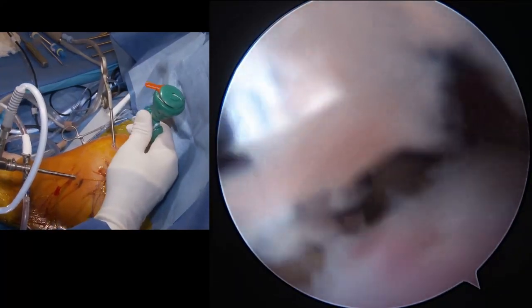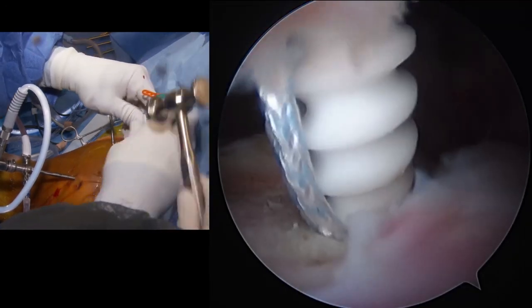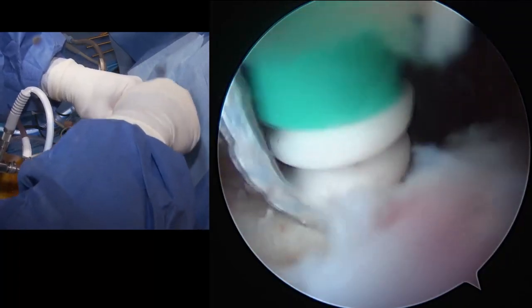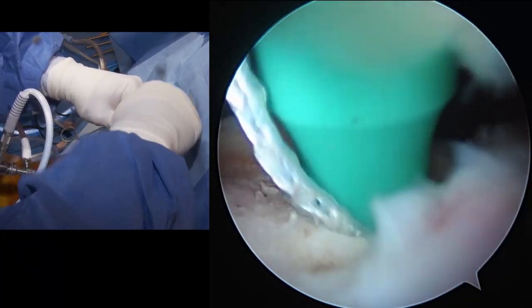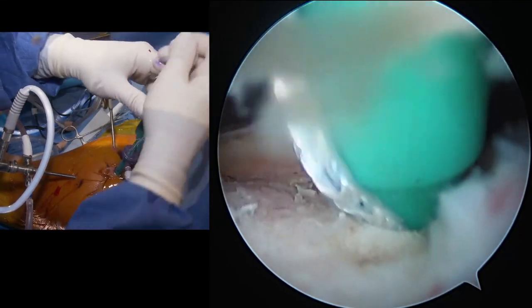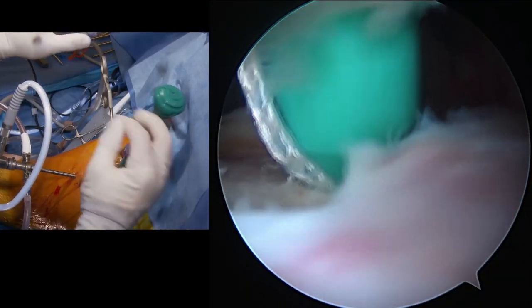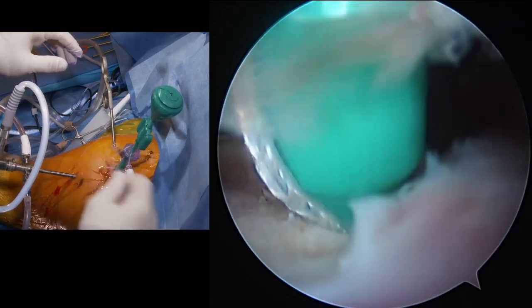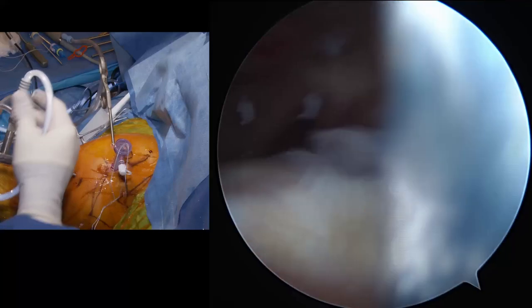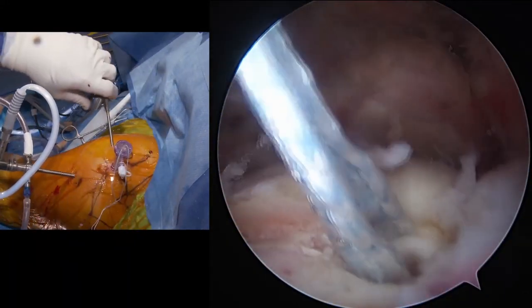Chris, hold the scope for me. Mallet, please. Just hold it right there. Go ahead, tap it. All right, it's good. And let's take a lasso to the left, please. And then we want to bury our anchor so it goes down at least level to the surface that we prepared. We don't want it to be prominent beyond that point. Okay, and Chris, could you go ahead and give me one of those 8.25 millimeter cannulas now? All right, let's go ahead and get that set up.